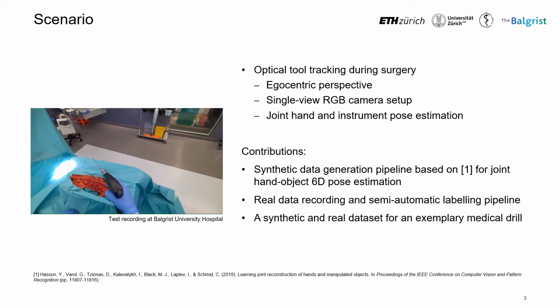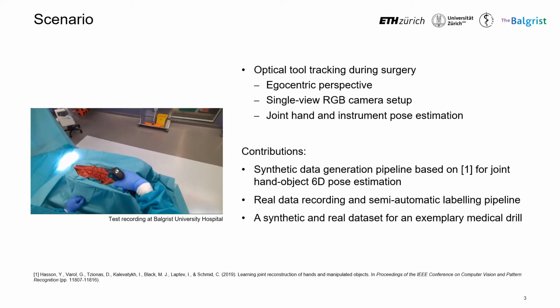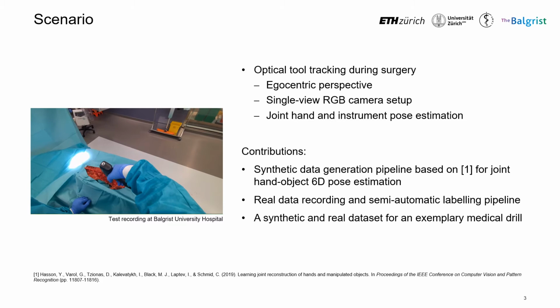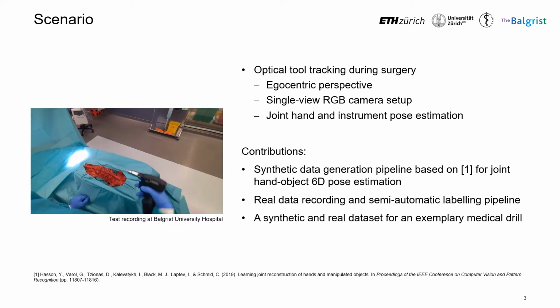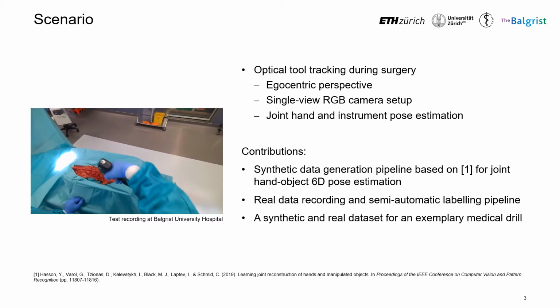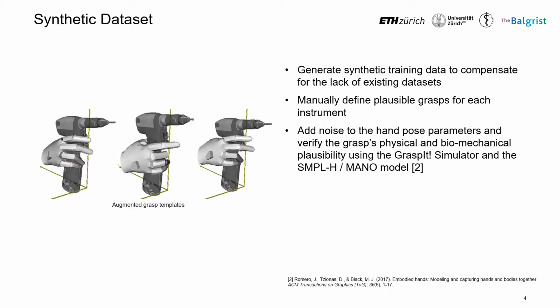Using these pipelines, we generate a synthetic and real dataset for the Colibri 2 medical drill, which you can see in the video. Both datasets can be used for joint hand and tool pose estimation. We follow previous literature and use synthetically generated data to compensate for the lack of existing datasets.